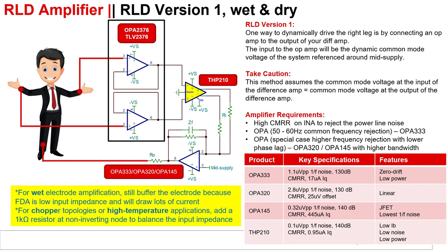If you're using a fully differential amplifier to measure the output of the electrode, you can use differential outputs to drive the right leg amplifier. The input of the op amp will be the dynamic common mode voltage of the system referenced around mid-supply. This feedback loop improves CMR by the amount equal to 1 plus A, where A is the closed loop gain of the feedback loop. The value of the closed loop gain depends on the values of the feedback impedance and difference amp output common mode sensing resistor. An excellent choice for an amplifier in the right leg drive is the OPA-333 zero drift amplifier.